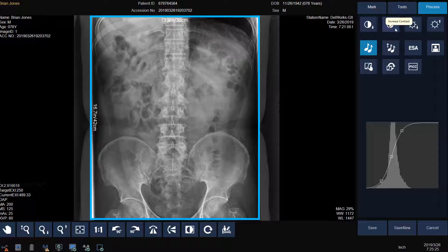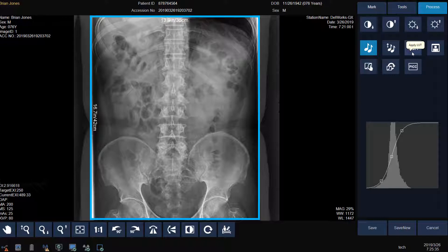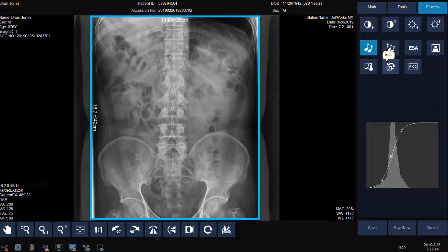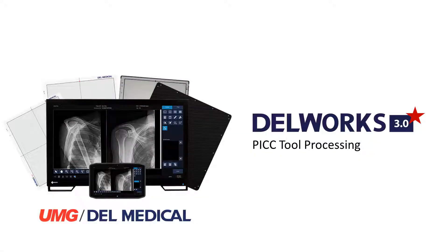Less commonly used tools are available under the Processing tab. You can adjust brightness and contrast, change the image processing algorithm used, apply a lookup table, reprocess the body part as a different body part, redefine the processing curve, or reset the processing curve.